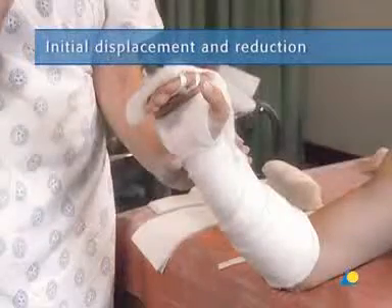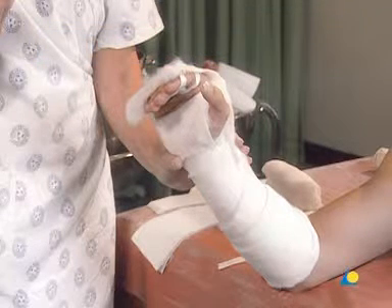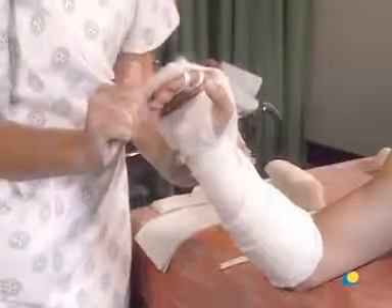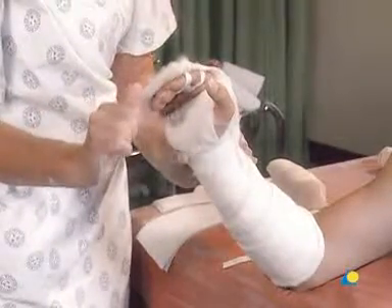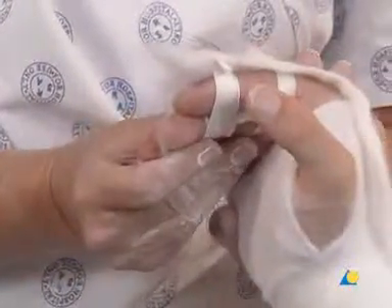In cases of a proximal phalanx fracture, there will always be volar angulation present. This volar angulation can be corrected by fully flexing the MP joint to 90 degrees. Additional volar pressure will result in the reduction of the fracture.